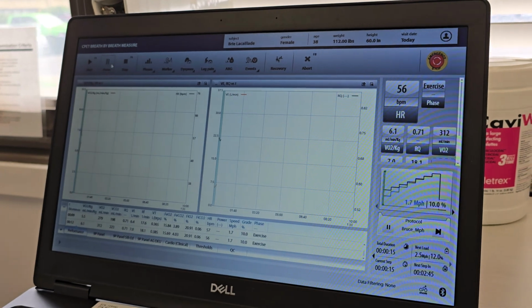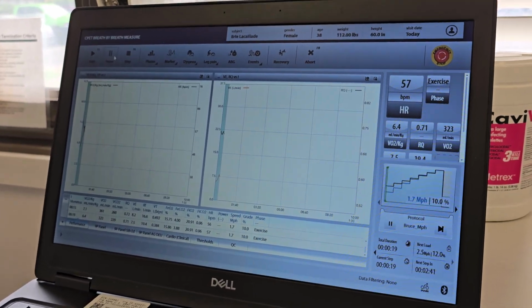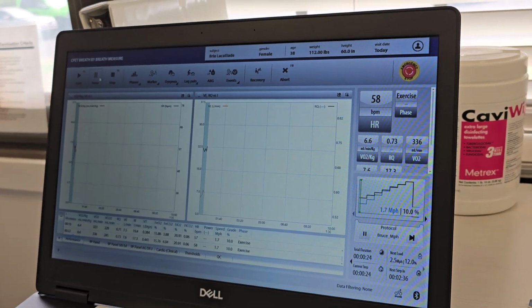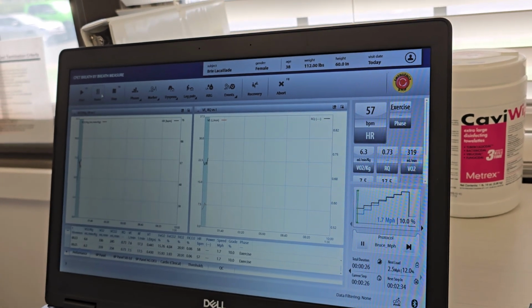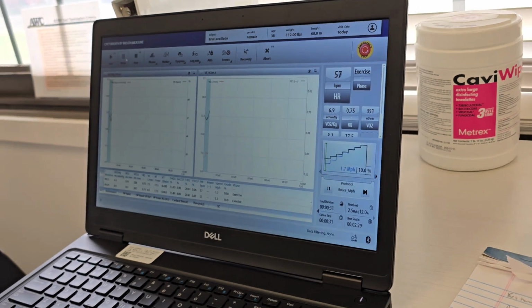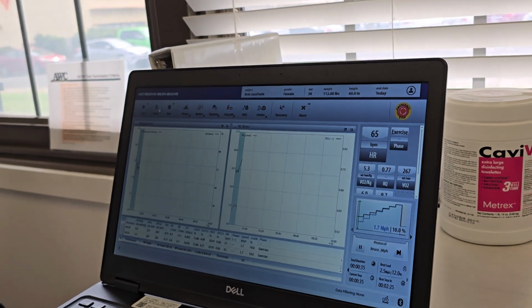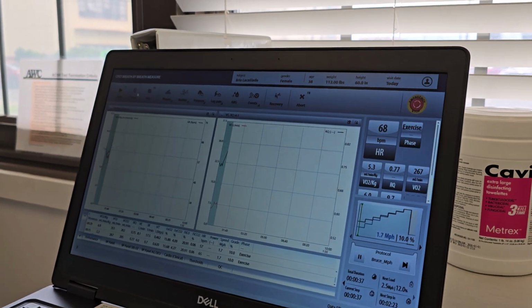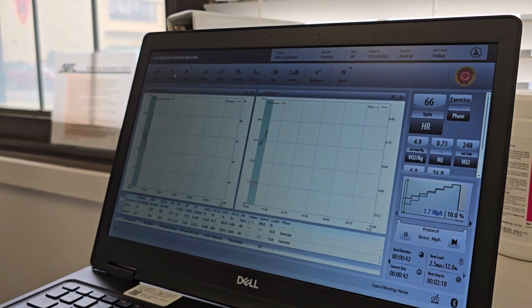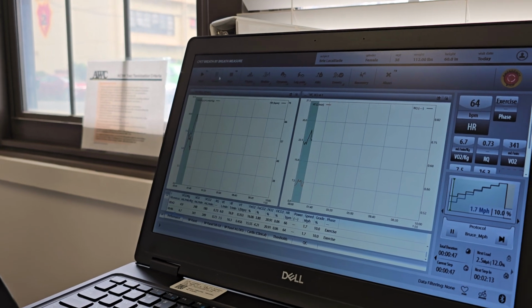Which actually, if you guys have an RS-232 adapter to a USB, do you have one? Yep. That's the one that works for all the Fitmates. Oh, this is an Ethernet. If you have one for a USB, like this end would be a USB, you can connect it into the computer and you can control it. And you can change speed and everything from the computer? Yeah, exactly. From here. Or we'll just use terminal.